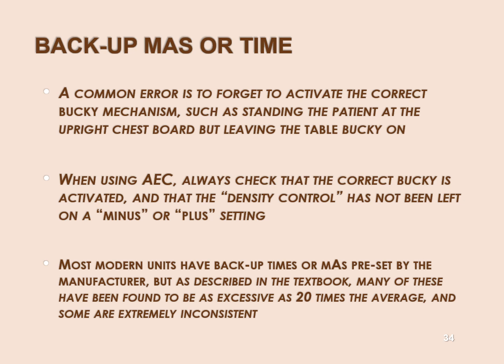So if you've got a digital detector that you can change from the table to the wall bucky, you activate the wall bucky, but you put the detector into the table bucky, it's going to say you're confusing me, because the image receptor's in the table, but you've activated the wall cells. Do you mean to activate the table cells? And you'll say yes. Okay.